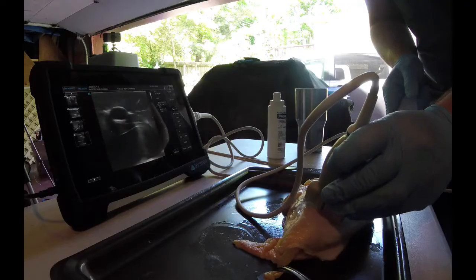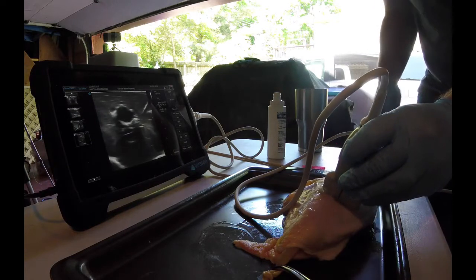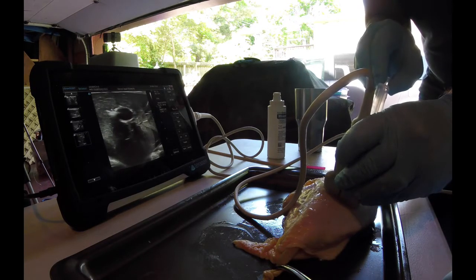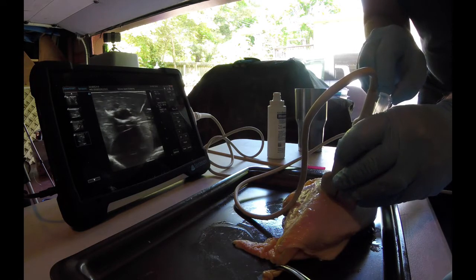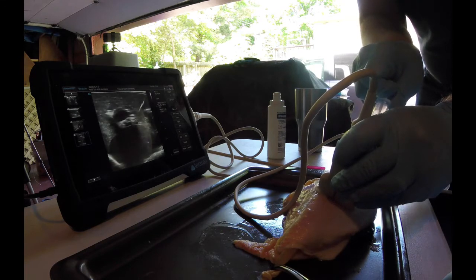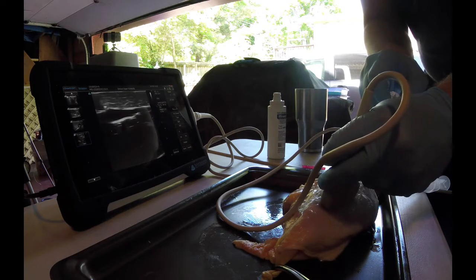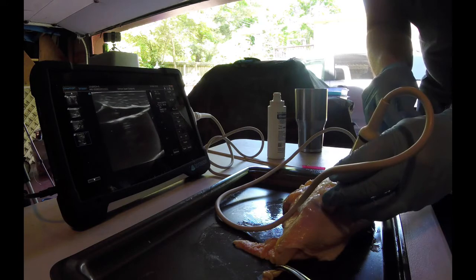Let's now see what it looks like — plumping it up. I'll hold this. There it is. There you go. Puncture it in and you're good to go. Really easy to do, a little bit on the gross side, but still very doable.